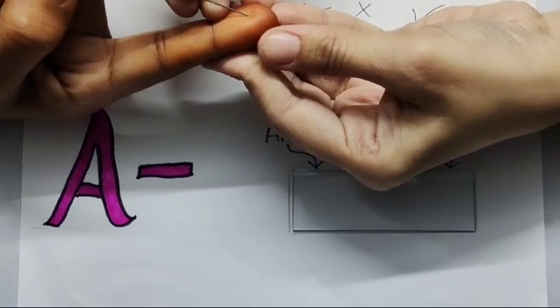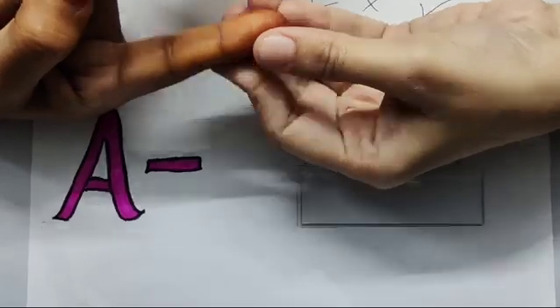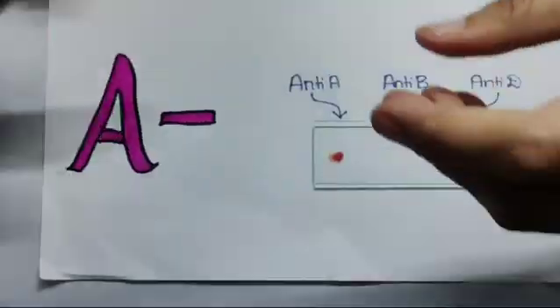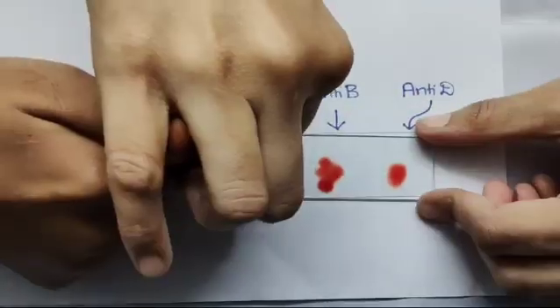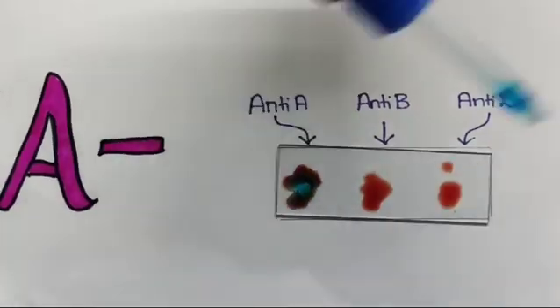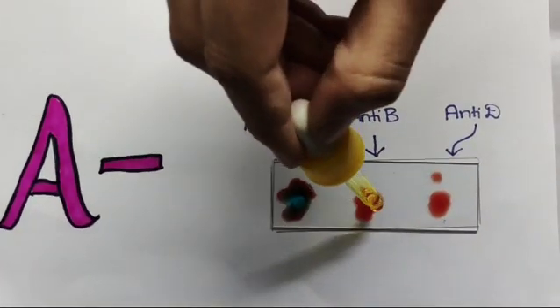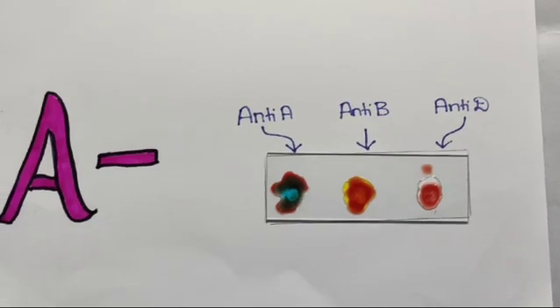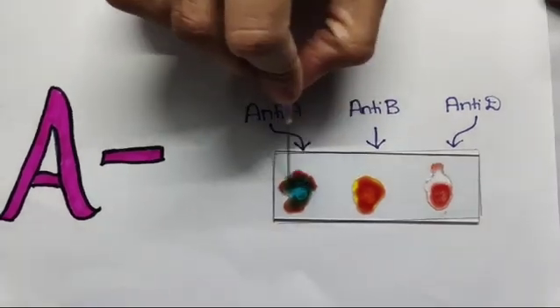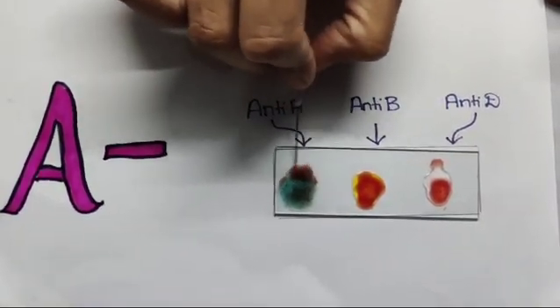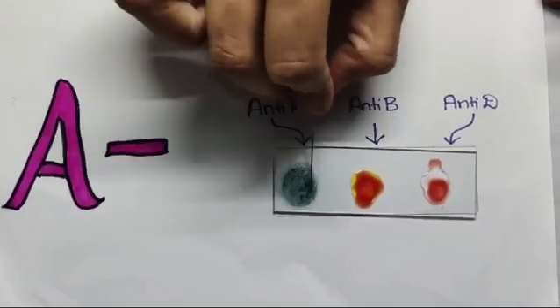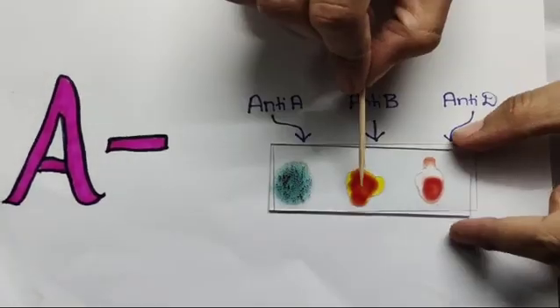Now let's see how to determine A negative blood group. Do the same procedure and check. Clotting is only seen in anti-A and not in anti-B. Hence, only antigen A is present and antigen B is absent. It is A blood group.